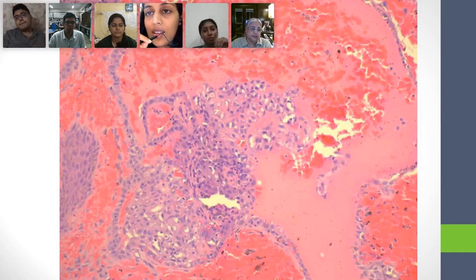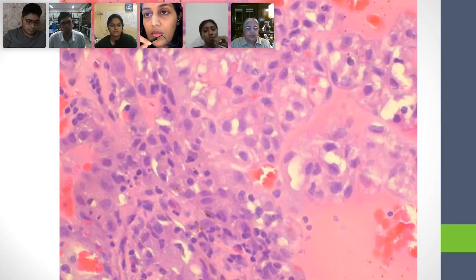Okay, the cytoplasm is eosinophilic, but some of the cytoplasm shows vacuolations, I feel. So you have got both. You're right. They're cuboidal or low columnar, and they have vacuolated or eosinophilic cytoplasm. Very good. And you've got this colloid-like material, it may be serum, I don't know, present within these cysts, and a lot of hemorrhage.